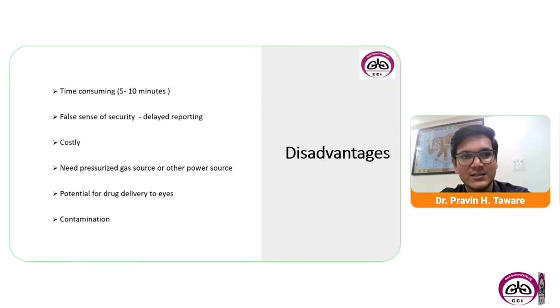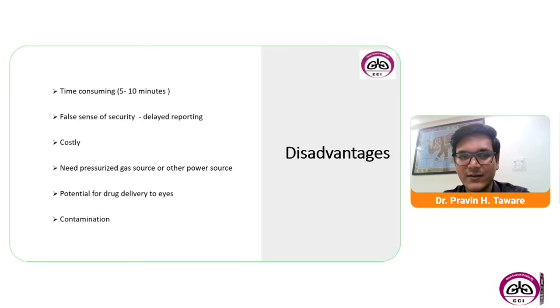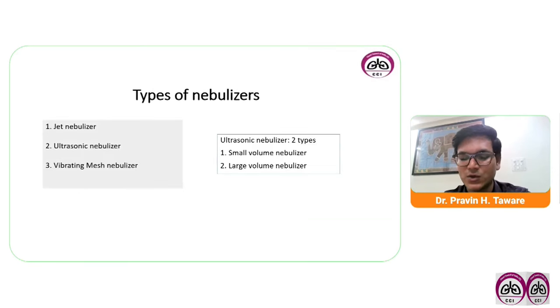What are the disadvantages? It is a time-consuming process, taking around 5 to 10 minutes, it gives a false sense of security, it is costly, it needs a pressurized gas source or other power source, there is potential for drug delivery to the eyes, and it can lead to contamination and nosocomial infection.